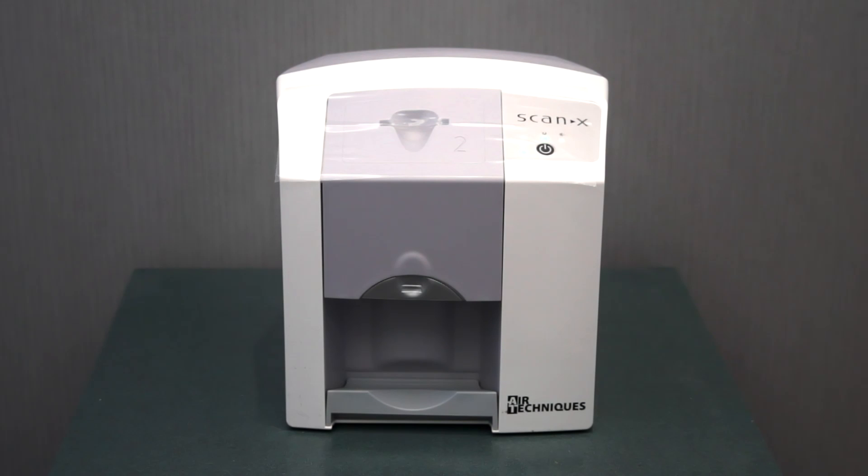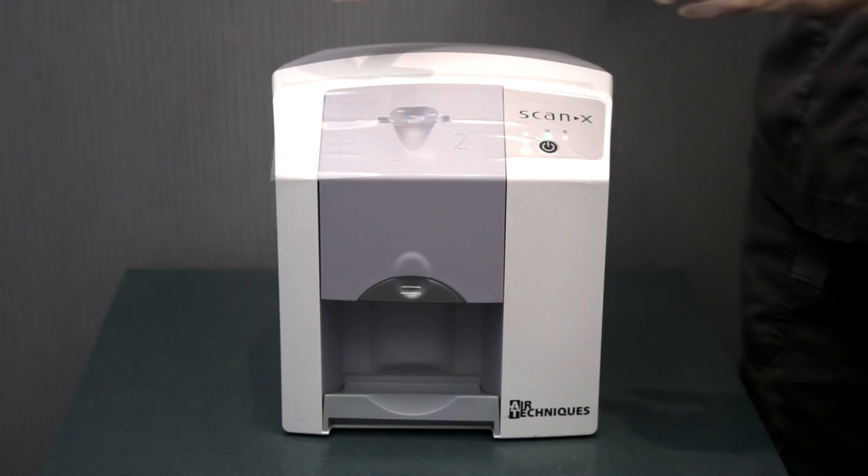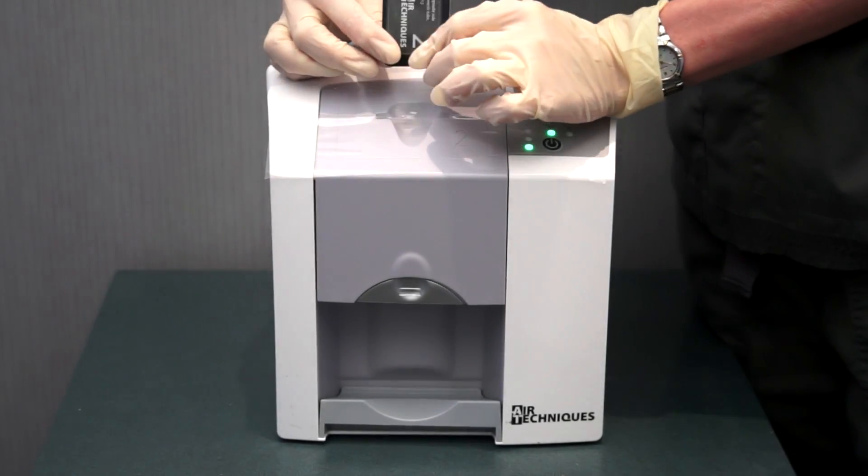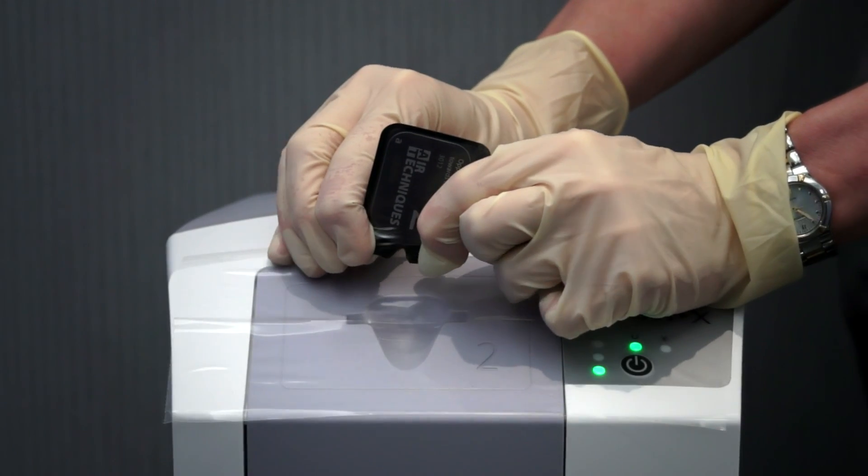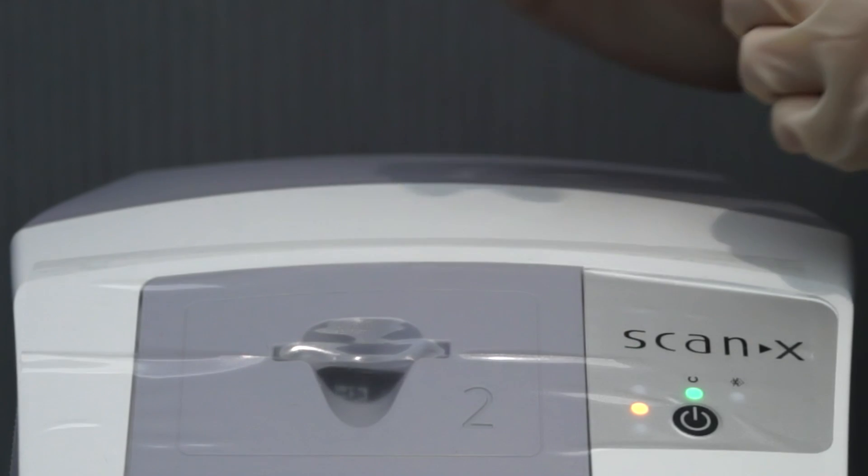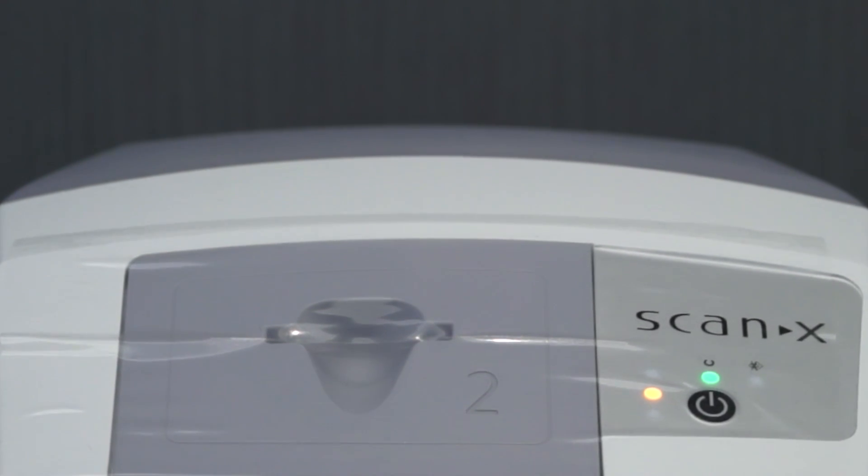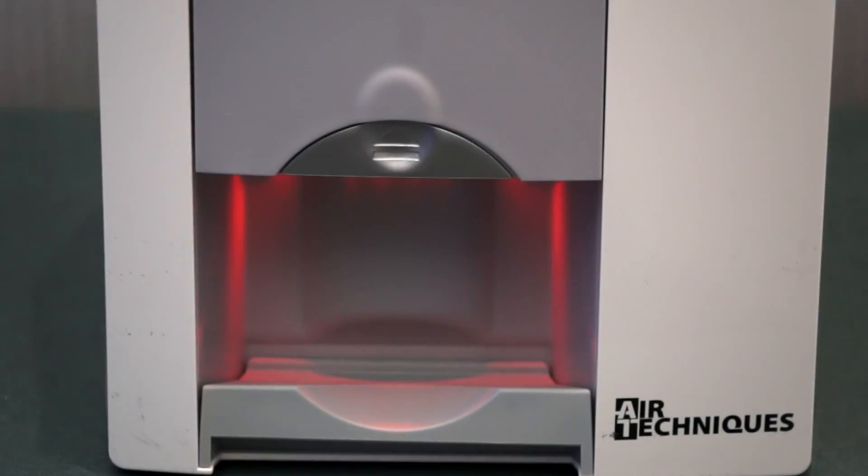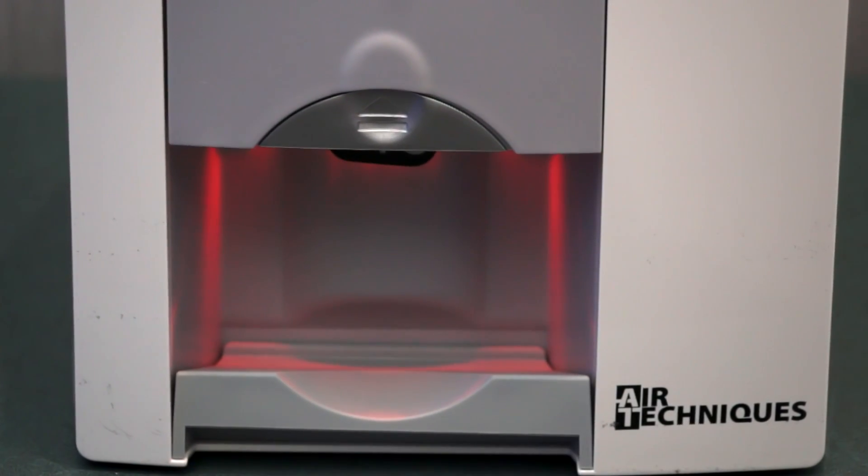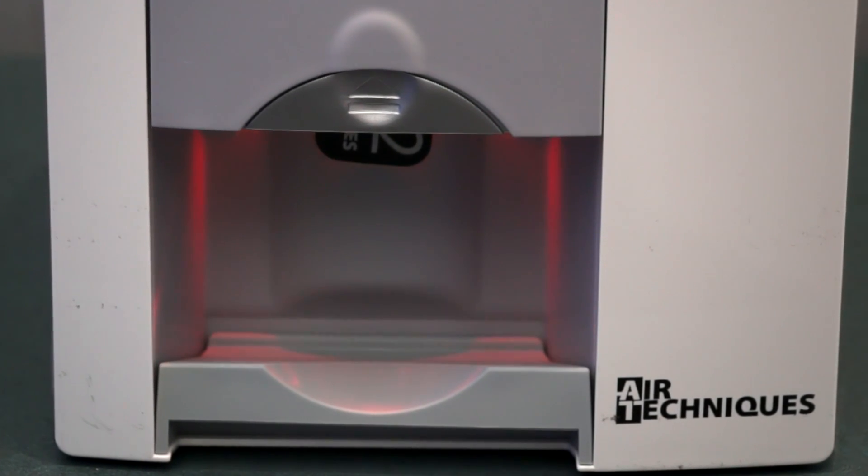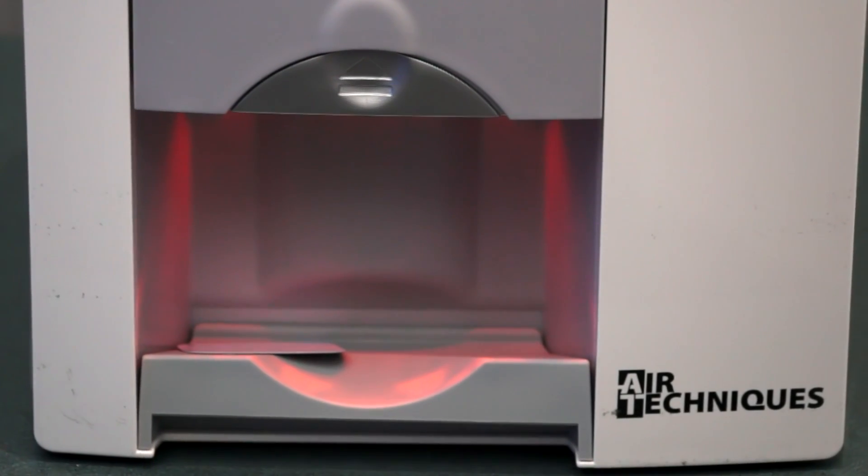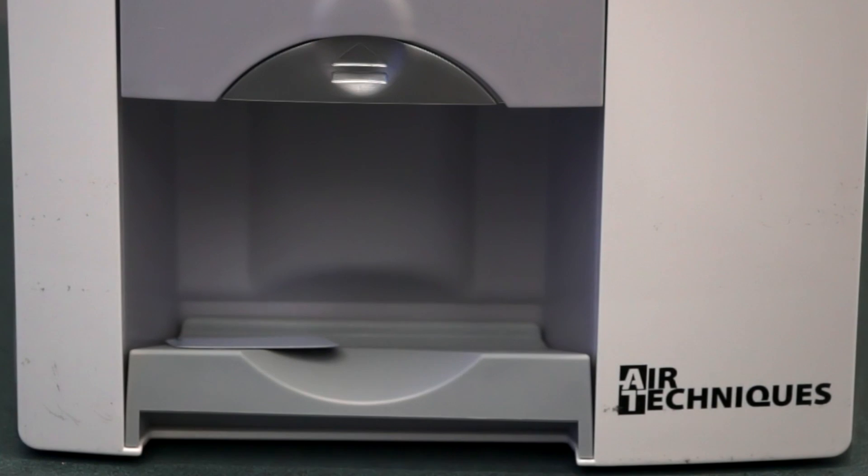Once the sensor has been radiographically exposed in the patient's mouth, it is brought to the ScanX Swift scanner. It is taken out of the infection control barrier, and the sensor is dropped into the slot on the scanner. The scanner will develop this over the next few seconds. The sensor, which is now being cleaned of information and is ready for the next use, drops out at the bottom of the Swift scanner.